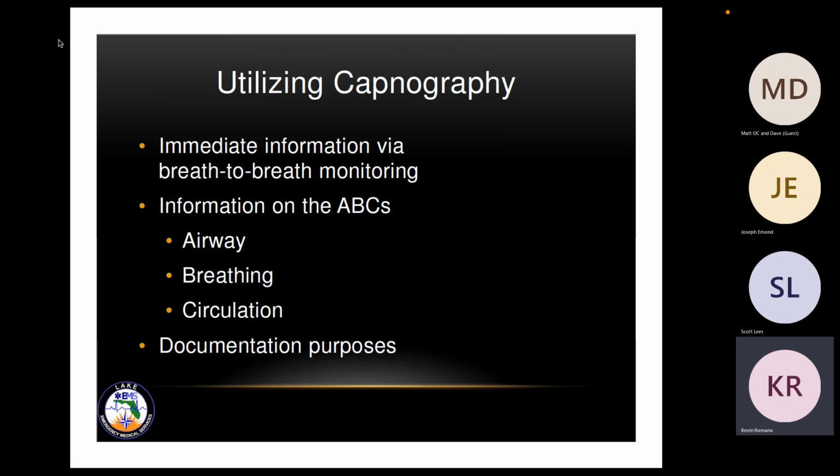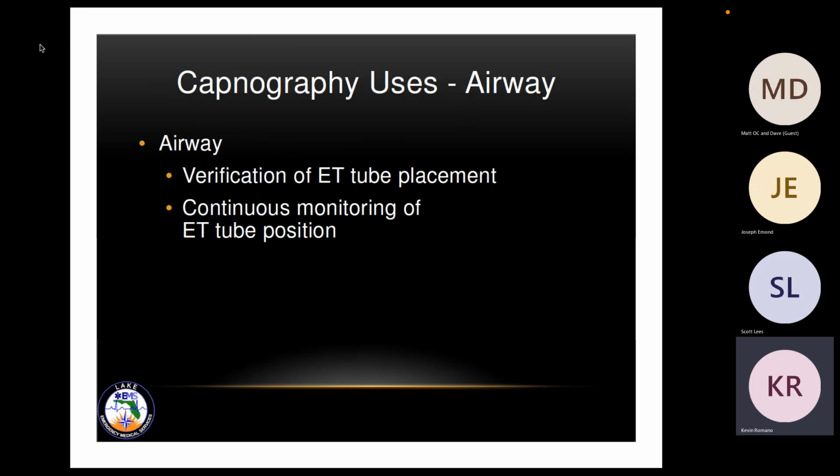So pre-hospital use of capnography. Immediate information via breath-to-breath monitoring. Immediately, we can see this. It's information on airway, breathing, and circulation. It also helps with documentation purposes as well. And we'll get into that.